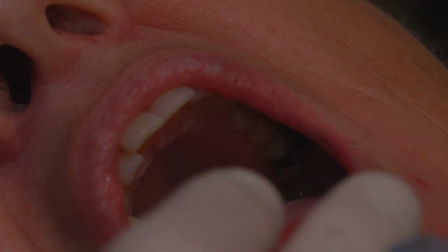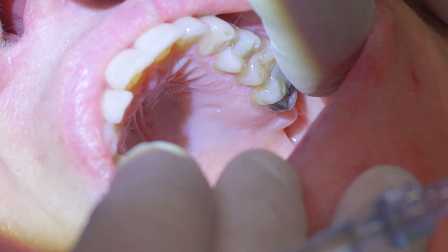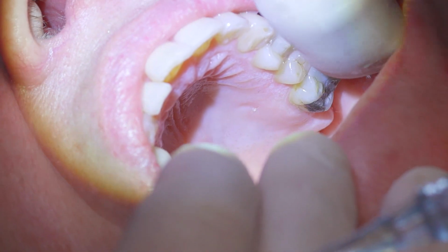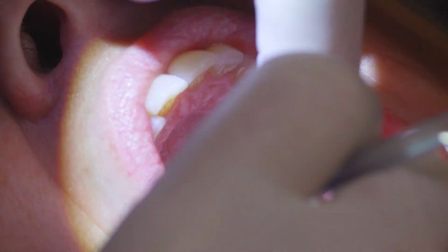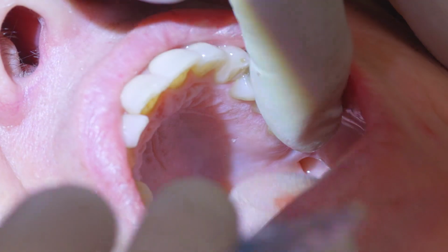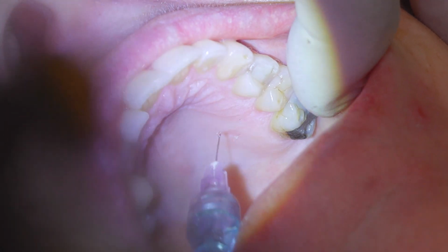All right, Heather, I'm going to numb up the top tooth now, and we're going to do it in a little different location. We're going to numb you on the roof of your mouth a little bit and then way on the back so you won't get any cheek numbing. And on your lower one, you didn't get any lip or tongue or any type of numbing, right? Perfect. Okay, so here we go. Just going to get a little tiny pinch.